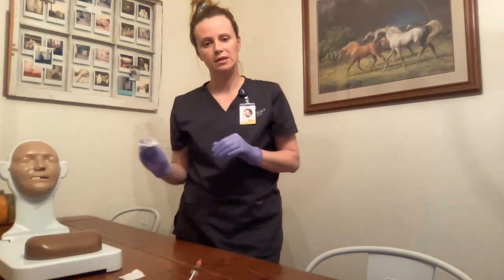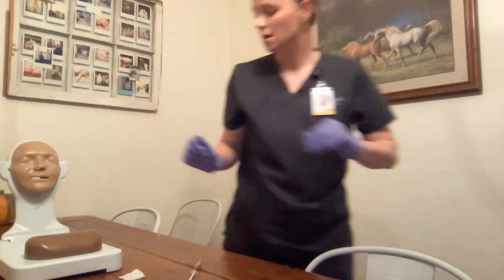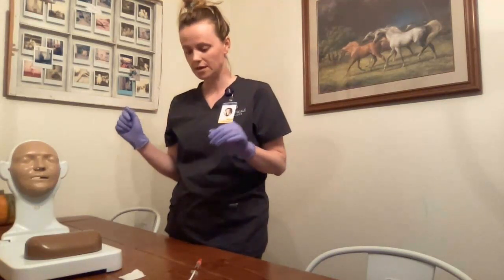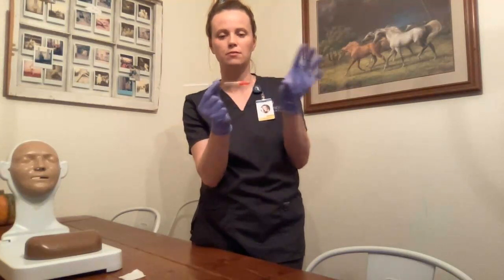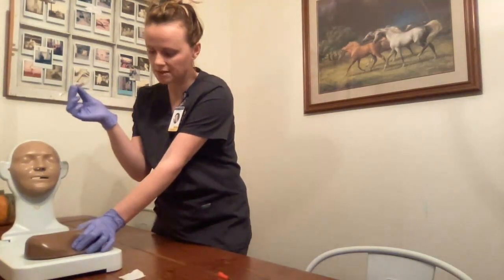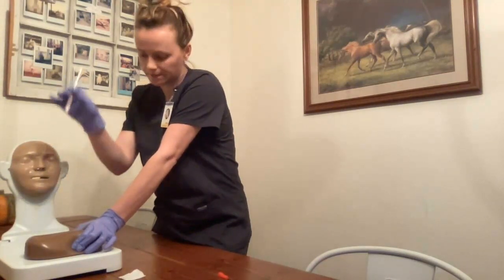Next, I want to pinch the skin and measure — I need to make sure my needle length measures half of the skin fold. It does, so that is okay for use. Then I will get my alcohol wipe and clean the site, starting at the center and working my way out two inches. Now that I have cleaned the site, I want to make sure I do not touch directly in the middle of the injection site. Next it is ready for injection. When injecting, I want to make sure I use these two fingers to hold, remove the cap, and once again pinch the skin to create a skin fold.